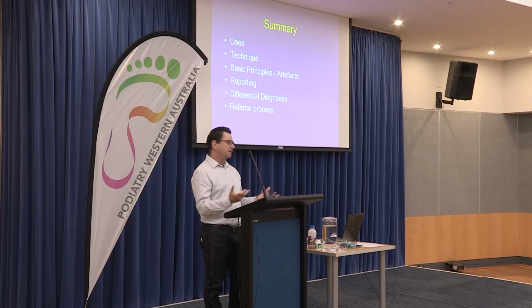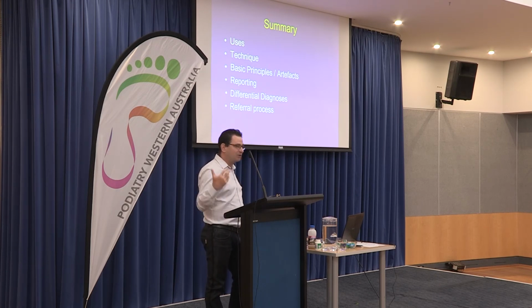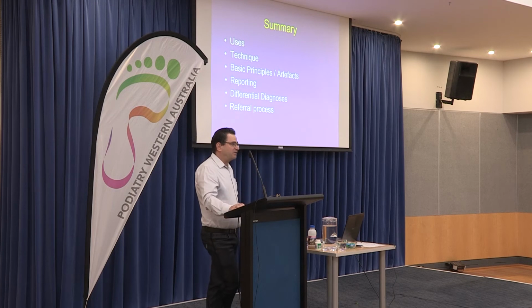And that's why, you think about tendons around the ankles. People say, well, ultrasound of the ankle is a poor man's MR of the ankle. Well, there's clearly things like the talocrural articular cartilage where ultrasound cannot see into the joints. There are some things that ultrasound can't do. But for things like para-articular tendons, I often actually prefer ultrasound to MR.